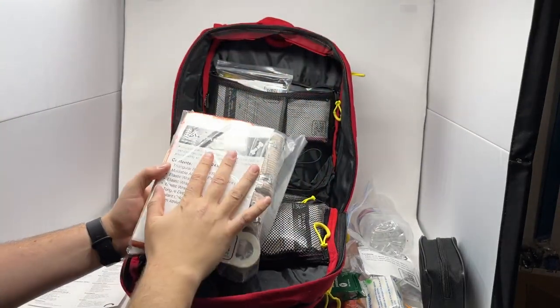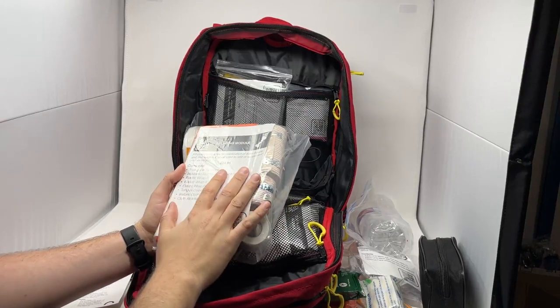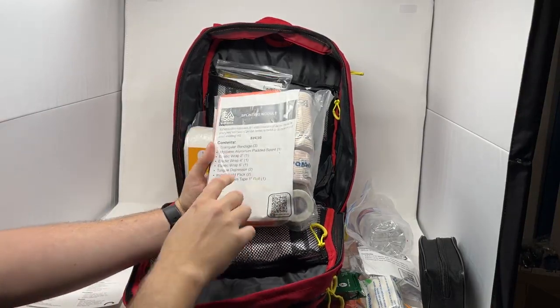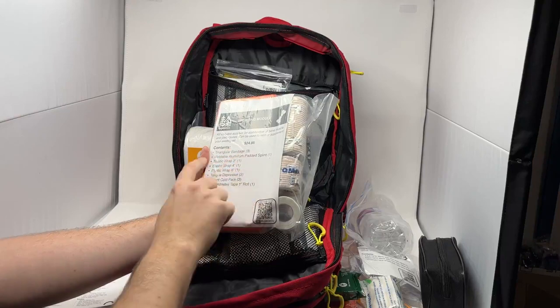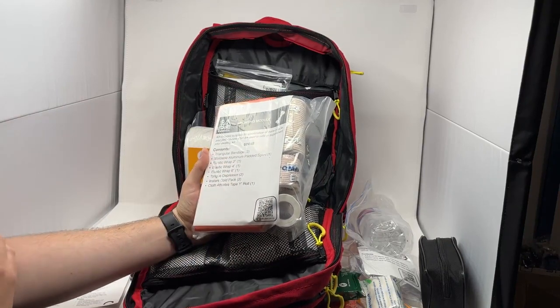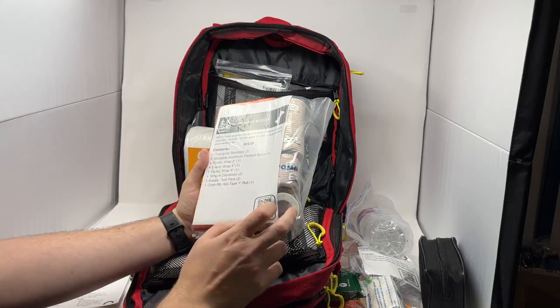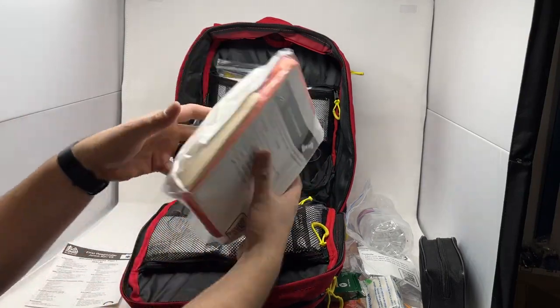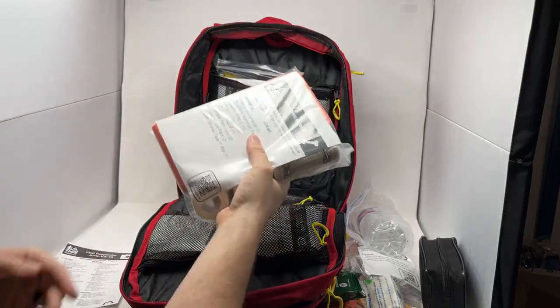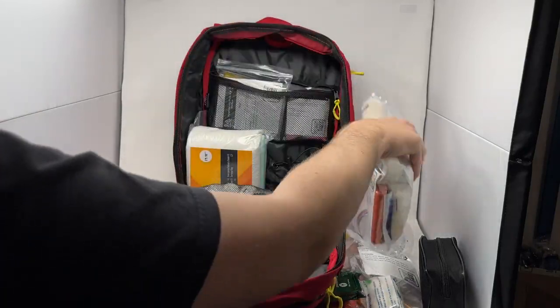We have our splint module, which covers everything for splinting bone, muscle, and joint injuries for most standard injuries. It comes with three triangulars, a moldable aluminum padded splint, a two-inch, four-inch, and six-inch elastic wrap, two tongue depressors, two instant cold packs, and a roll of one-inch cloth athlete's tape. These modules are easily replaceable at wildmedkits.ca — you can just buy a whole new module to swap them out.